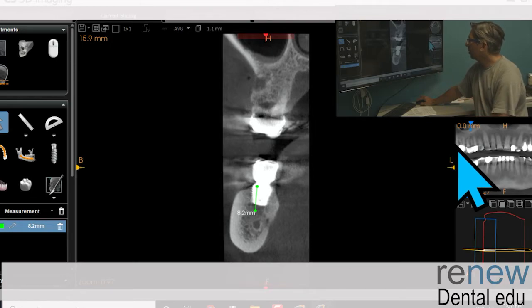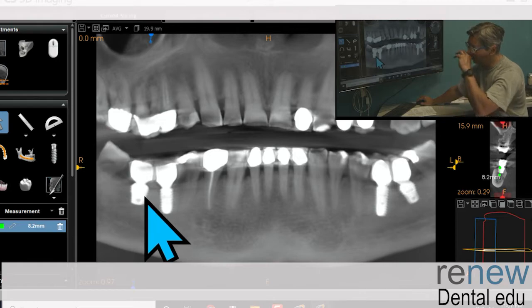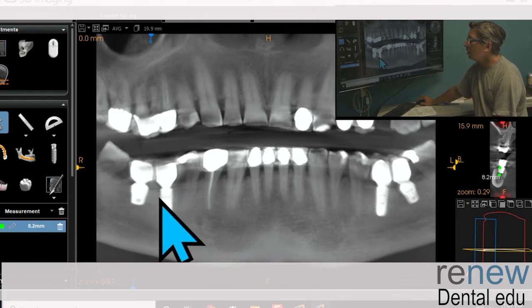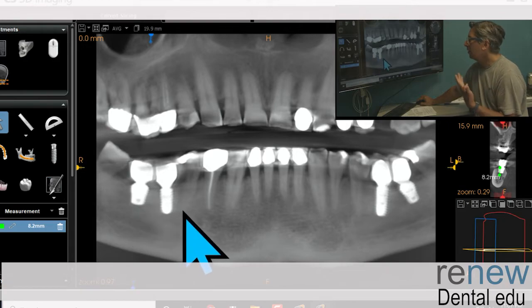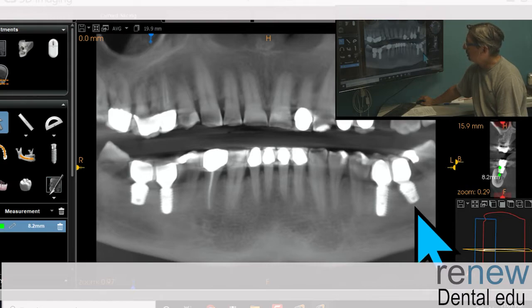Could have been buried a little bit more as well, obviously, or I'm not really sure if the bone has receded back. I don't know the case from the start. So given that both of them are very similarly placed, it's hard to say, do we have a little bone recession here or not? It looks identical over here. It looks even a little longer here, and it looks like the same implants here.